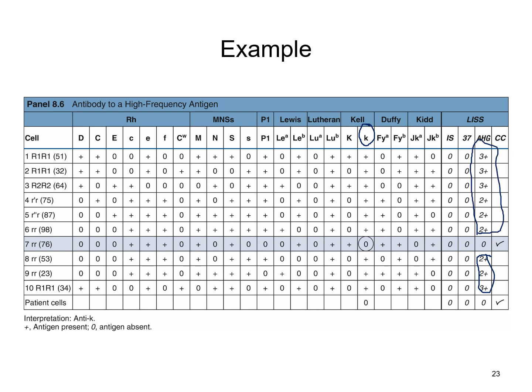If I were to work this up in my lab and I suspected that this is what it was, I have no anti-little k reagents in my blood bank, so I would have to send this to a reference lab for confirmation anyway. And potentially, if this patient needs to be transfused, they may even need to look for those donors for you in the rare donor registry.